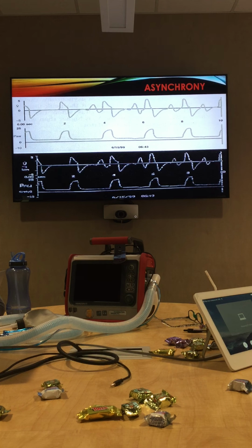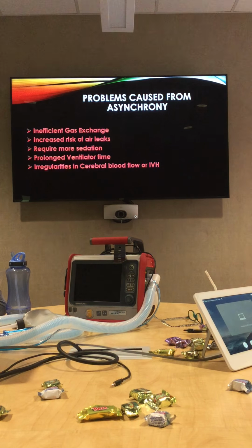Regarding ventilator synchrony, this is a patient that's actually on IMV, not SIMV, but they're breathing around it. The purpose is mainly to show you the difference. Obviously they're breathing on their own in between breaths, so they're very asynchronous, taking as many breaths as they want. That's not the way we try to ventilate patients typically. So you're going to want to make sure you try to control your patient, whether by sedation, or ways to treat this, basically put them in SIMV and give them some pressure support if that's what you have them on.